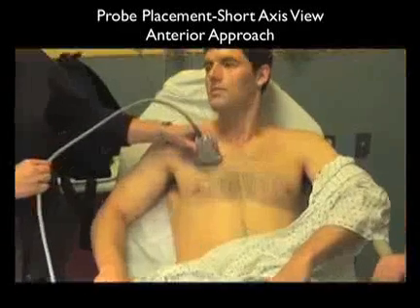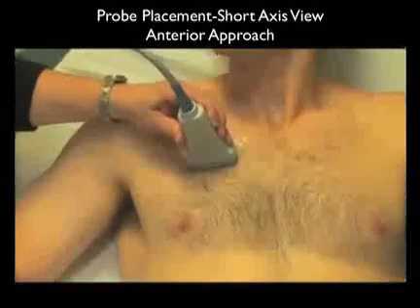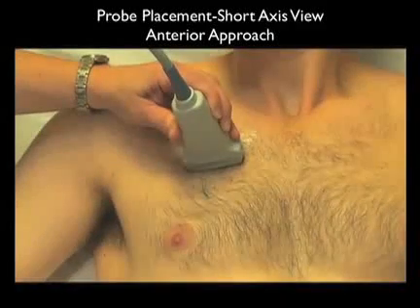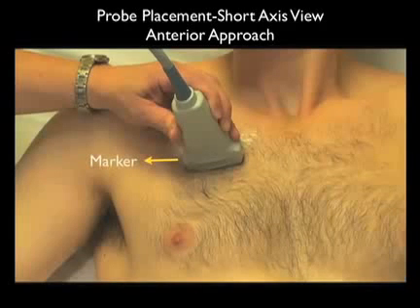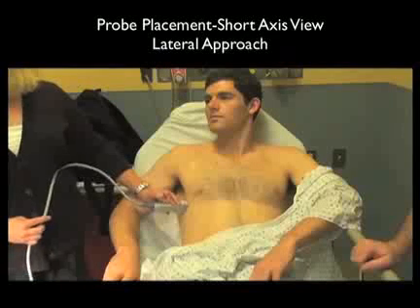Here we have the probe oriented in a transverse or short axis orientation between the ribs, looking directly down at the pleura. Notice in this case the marker dot is located towards the lateral aspect of the patient. Using both long and short axis configurations will allow you to detect a pneumothorax with a high degree of accuracy.